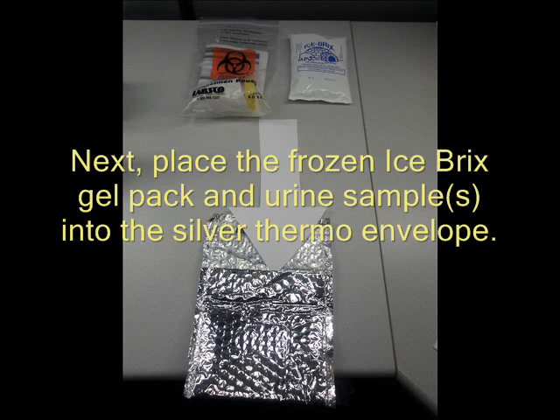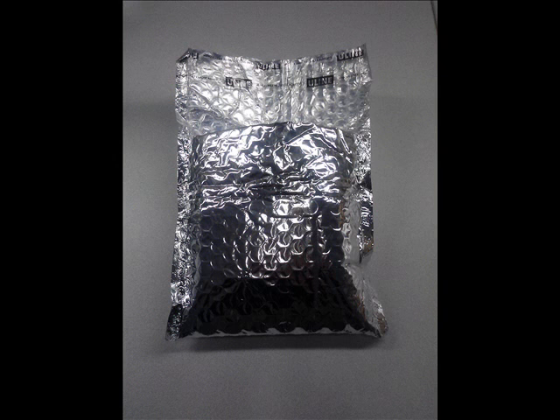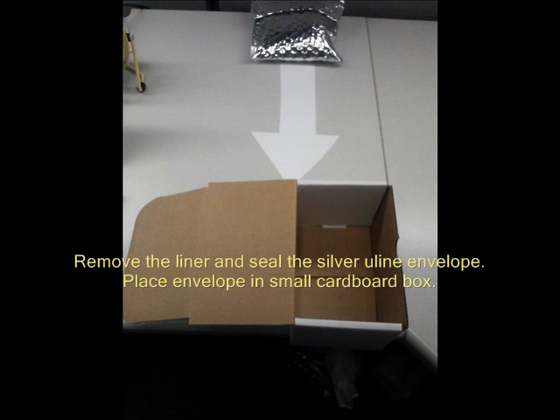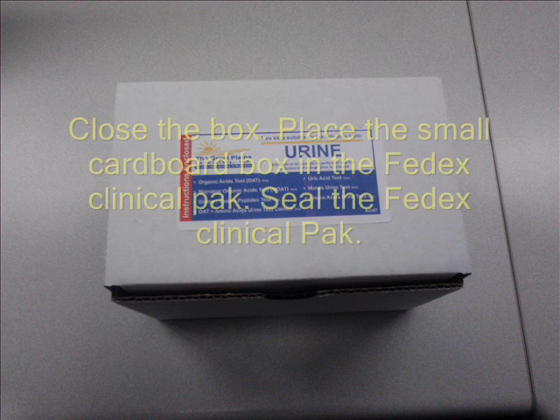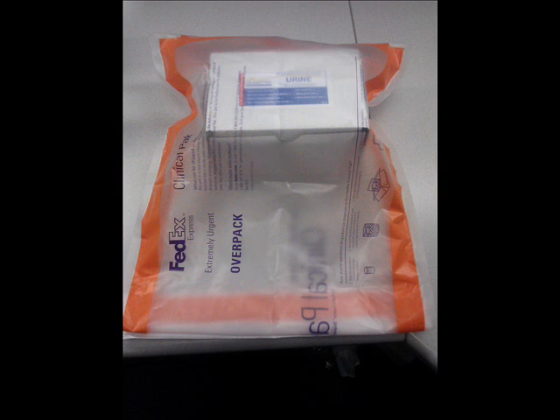Place the frozen ice brick gel pack and the urine samples into the silver thermo envelope. Remove the liner and seal the silver U-line envelope. Place the silver U-line envelope in the small cardboard box. Close the box, then place the small cardboard box in the FedEx Clinical Pack. Seal the FedEx Clinical Pack per the instructions on the outside of the pouch.